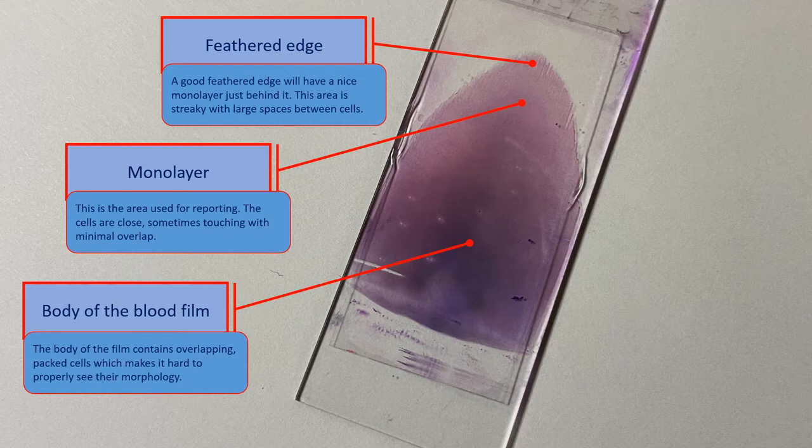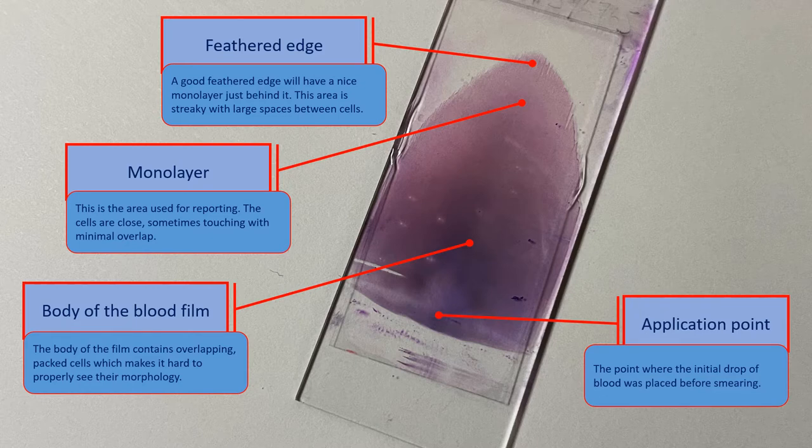On some blood films, you may notice a circle of concentrated blood at one end. This is known as the application point and is where the initial drop of blood was placed before smearing.